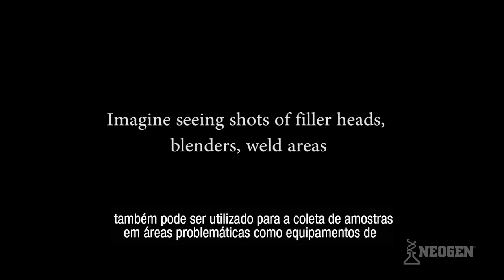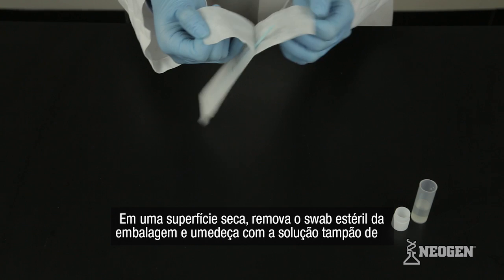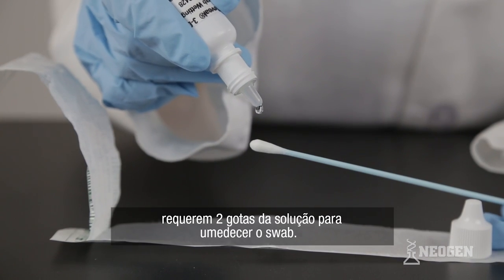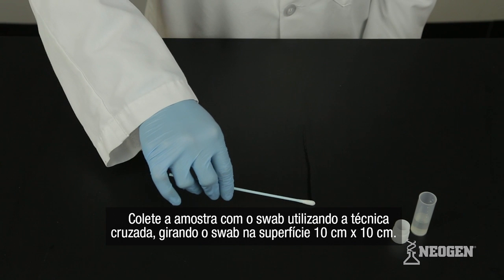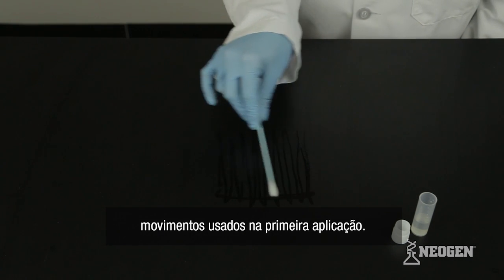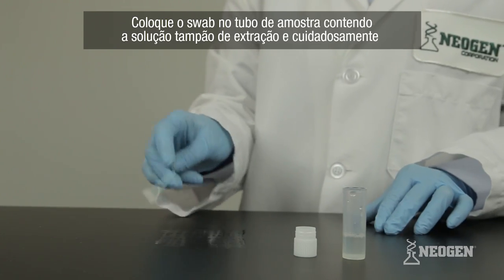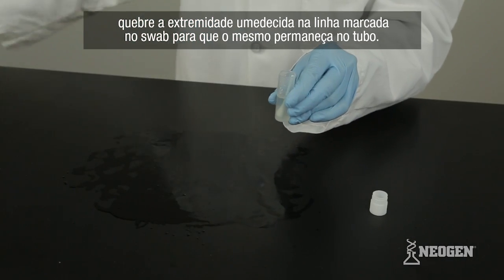Alternatively, use the swab to collect samples from problem areas like processing equipment, mixers, or filler heads. If you're swabbing a dry surface, remove a sterile swab from the packaging and wet it with extraction buffer by dipping it in the sample tube. Other Reveal 3D kits that provide a swab wetting solution require you to wet the swab using two drops of swab wetting solution. Swab your 10 by 10 centimeter area using a crosshatch technique while revolving the swab on the surface. Repeat the swabbing procedure using movements at right angles to those used in the first swabbing. If swabbing a wet surface, do not moisten the swab prior to use. Place the swab into the sample tube that contains the extraction buffer, then carefully break off the moistened end at the pre-scored mark so that it remains in the tube.